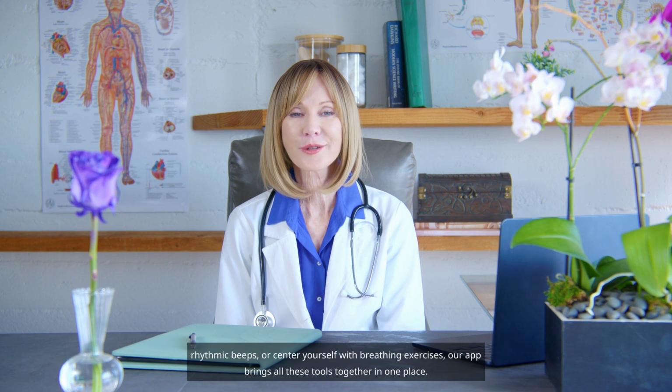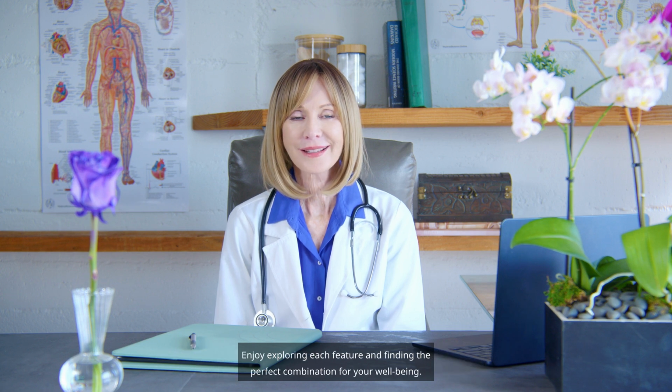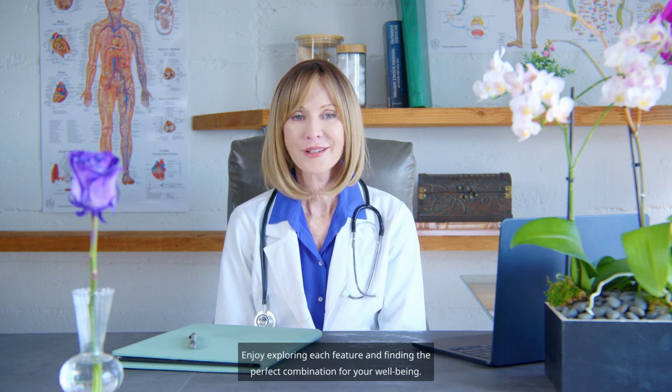Whether you want to mask tinnitus with tailored noise, focus with rhythmic beeps, or center yourself with breathing exercises, our app brings all these tools together in one place. Enjoy exploring each feature and finding the perfect combination for your well-being.